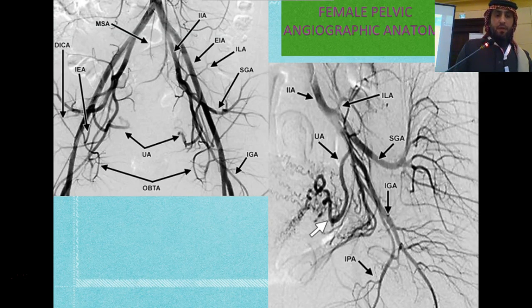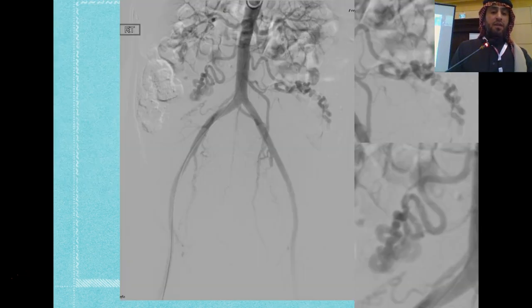So as interventional radiologists, we try to teach our residents that it's very complex. You have to open your field of view always when you are doing angio. Sometimes you look for a uterine artery, but don't forget the other collaterals like obturator, internal pudendal arteries, round ligament artery, and normal variants like ovarian arteries sometimes supplying the fibroid you take care of.